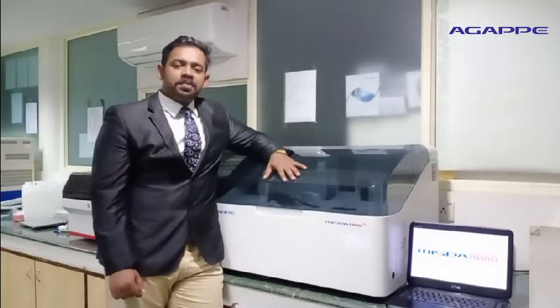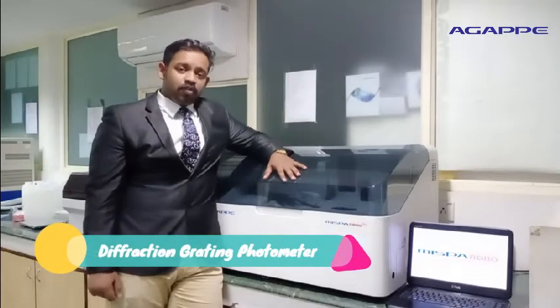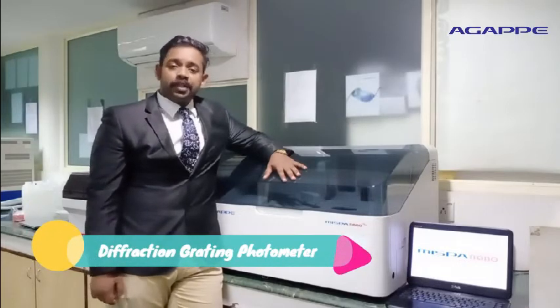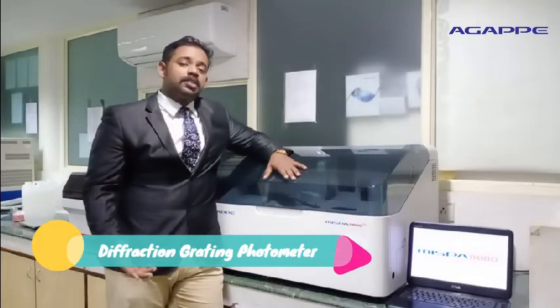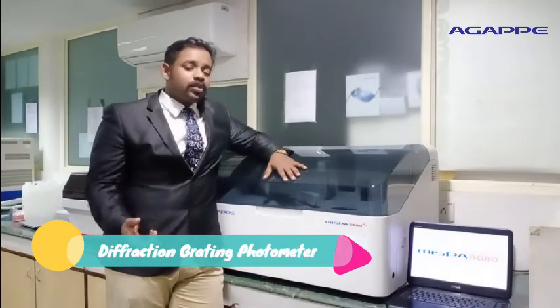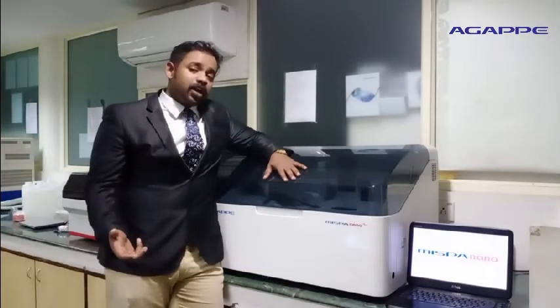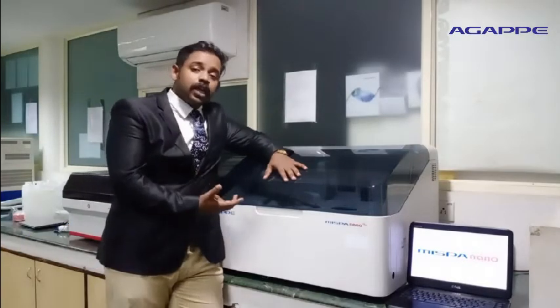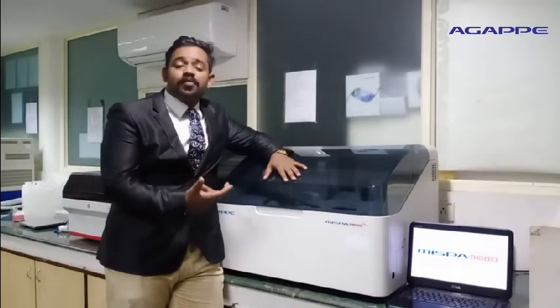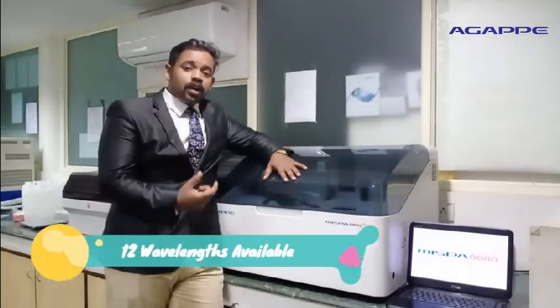The prime feature in MISPA NanoPlus is the presence of a diffraction grating photometer, which is a multiple prism arrangement that can separate wavelengths of light using the principle of diffraction. This is mostly available in high-end fully automated analyzers, and the diffraction grating photometer in MISPA NanoPlus replaces the conventional interference filter photometer from the range of similar equipment.